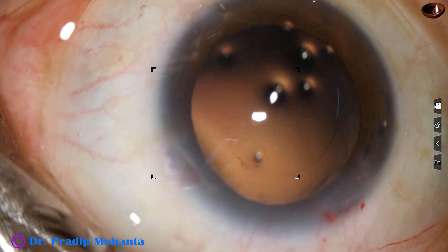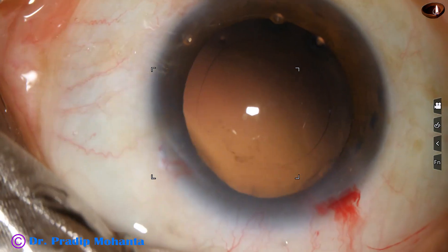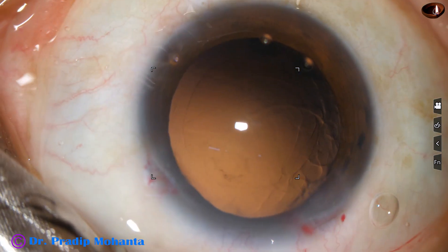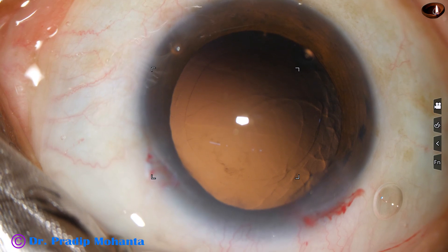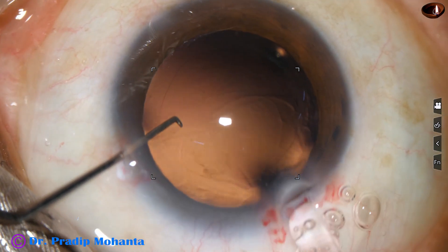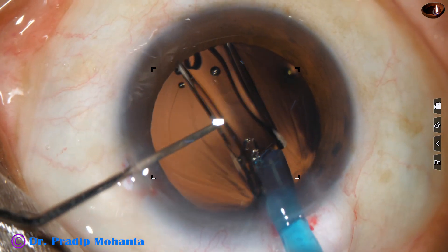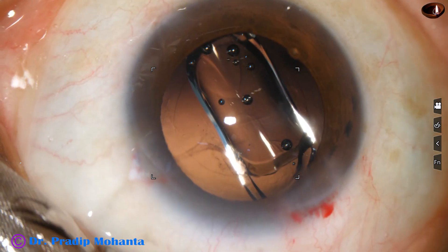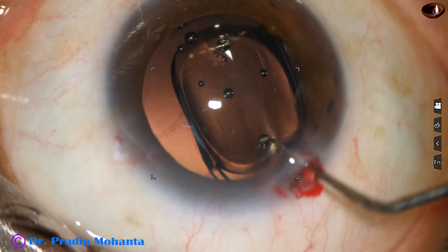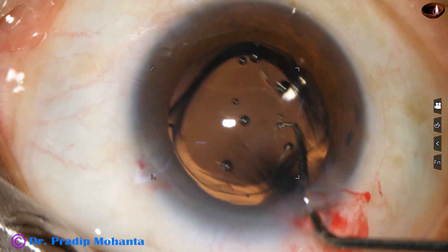The posterior capsule is polished by irrigation. And now a hydrophobic acrylic single-piece monofocal intraocular lens is implanted in the capsular bag. The capsular bag is filled up with 2% HPMC, and here goes the intraocular lens. The leading haptic goes into the capsular bag and the trailing haptic also goes into the capsular bag. This is the Hoya Nanix — a beautiful lens. The cartridge is very thin; it goes through 2.2 millimeters and easily through 2.8 into the middle of the anterior chamber.